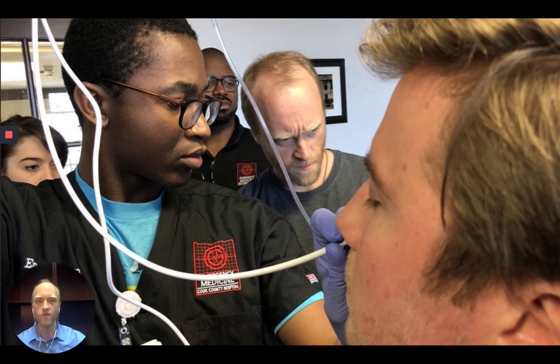I think it's great if two or more physicians who are learning the procedure can meet up and practice on each other with mentorship from someone experienced in the procedure. The participants do not necessarily need to intubate each other, but doing the topicalization and driving the scope through the nasopharynx on a real person, and having it done on them, really builds their confidence, and it also helps them talk their patients through the procedure in the emergency department as they have experienced the procedure themselves.